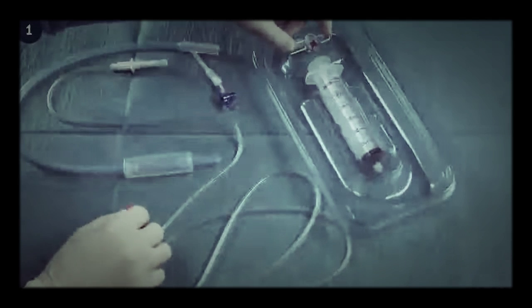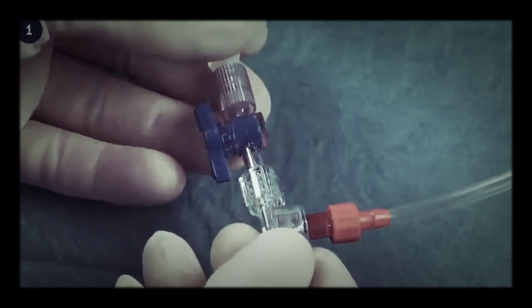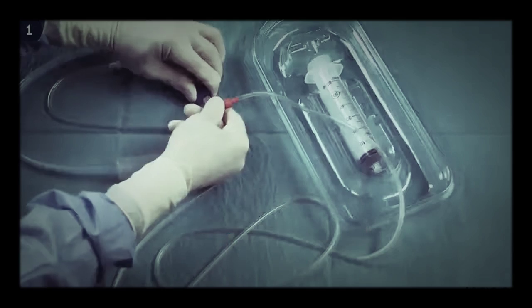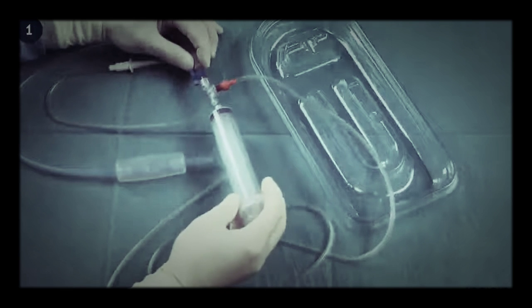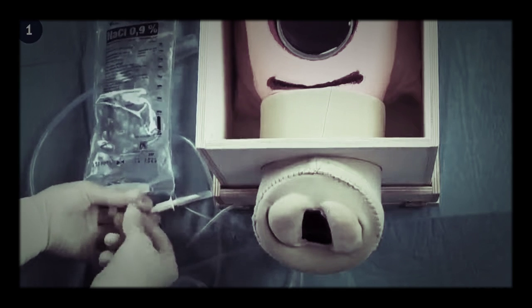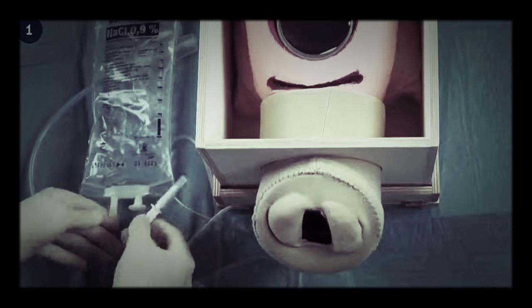The giving set is attached to the top of the three-way connector. Then the Bakri balloon and the syringe are attached on opposite ends of the three-way connector. Lastly, the IV giving set is connected to a bag of saline solution.